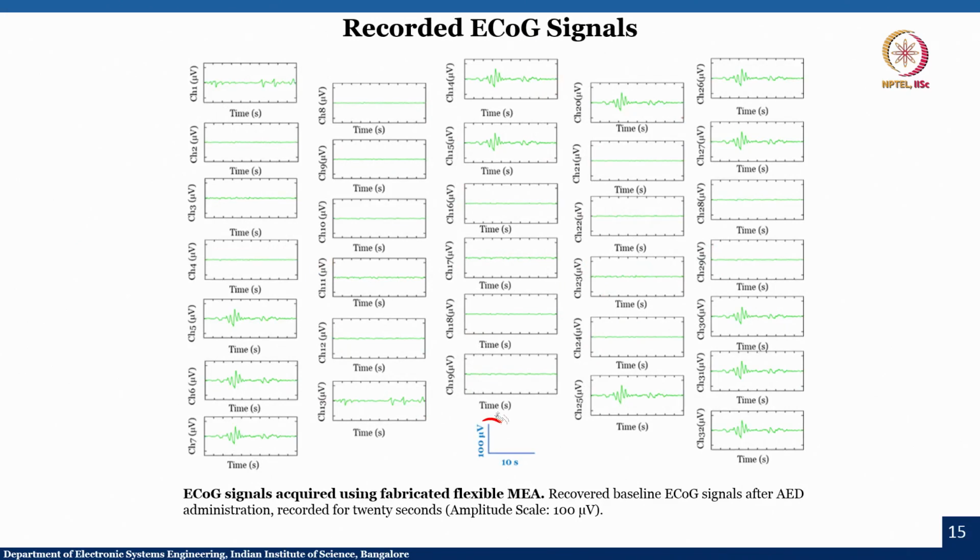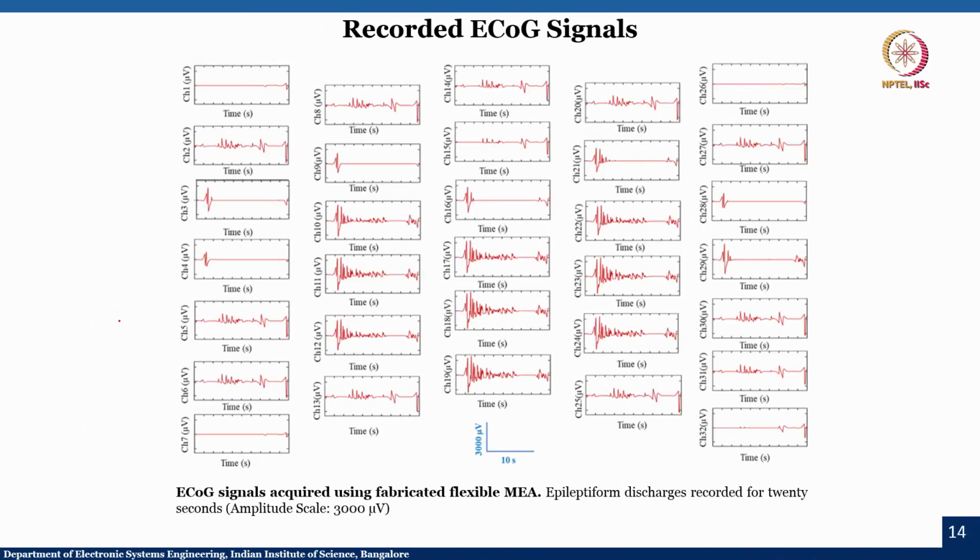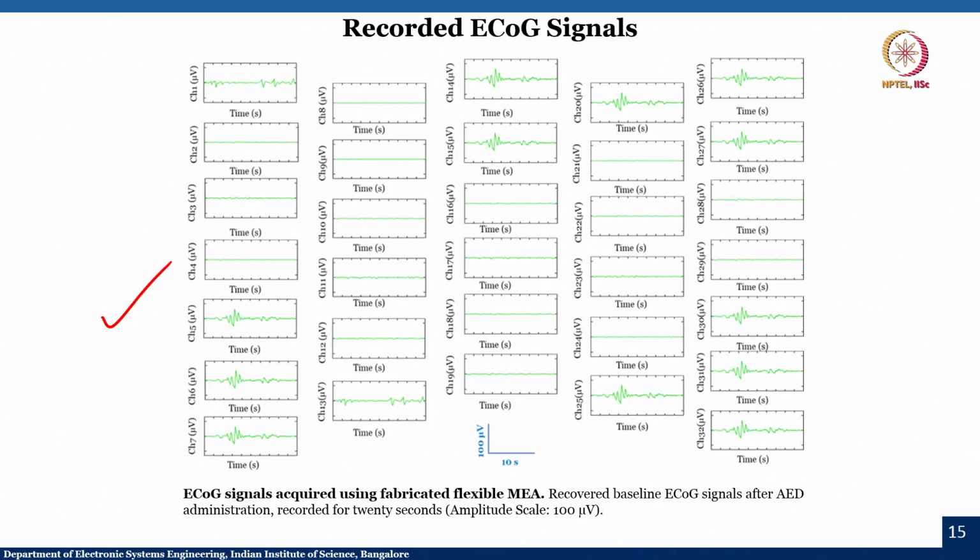What I am saying from this is that if the anti-epileptic drug is effective, you can recover the baseline. If you see the baseline, it looks like this. Now, when you create epilepsy, it looks like this. If the epileptic drug is good, it looks like this, you see. So you have recovered the baseline, that is what it means.